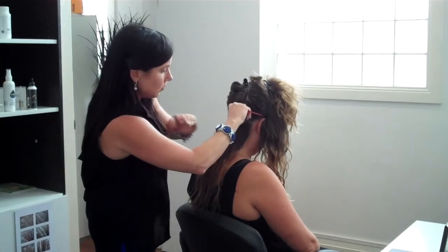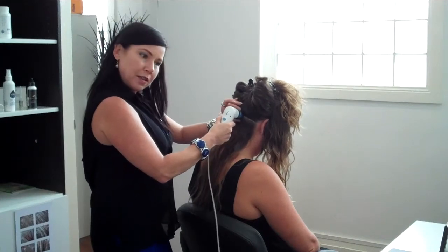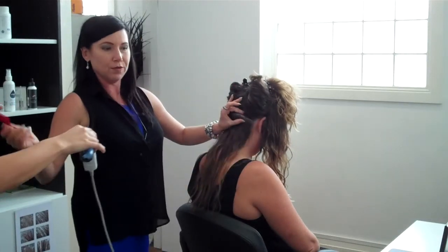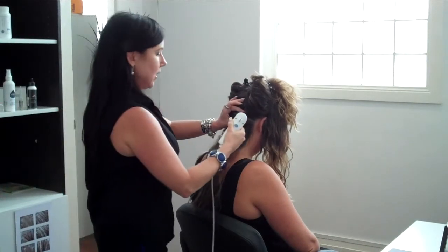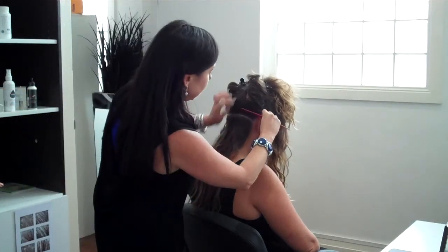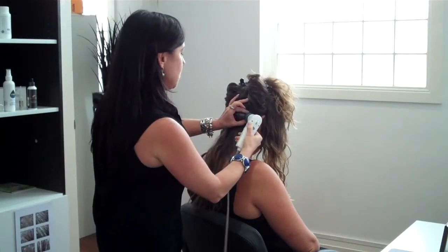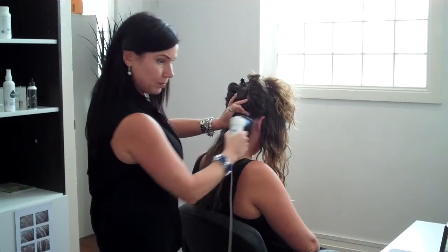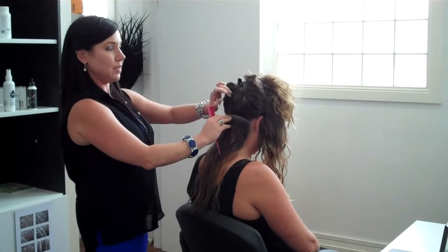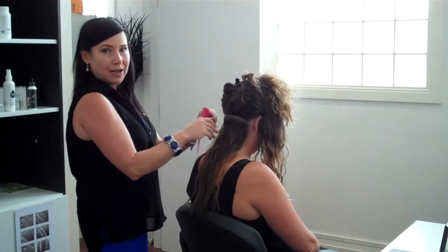The particular microscope that I use has what we call an epidermal and a dermal image. So we take a picture on the surface of the scalp and we also take a picture underneath the scalp, so you can find those little translucent hairs as well. I don't prep the scalp anymore — I like to see what the client is doing with their hair loss treatments at home, because if the scalp is dirty we need to adjust it. I generally do about five spots in each pathway, at five centimetres and ten centimetres, then move into the recession.